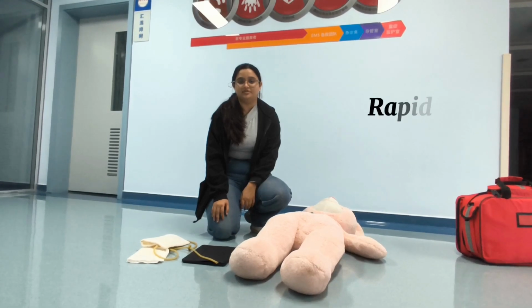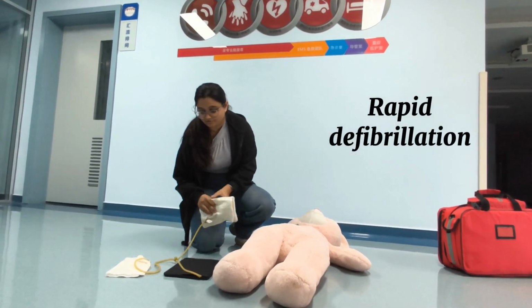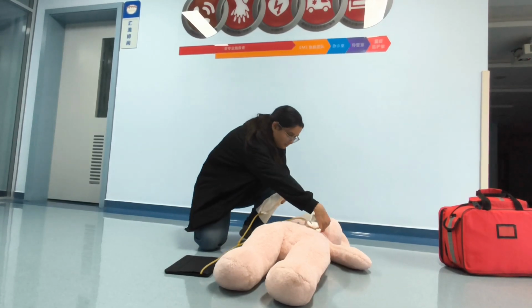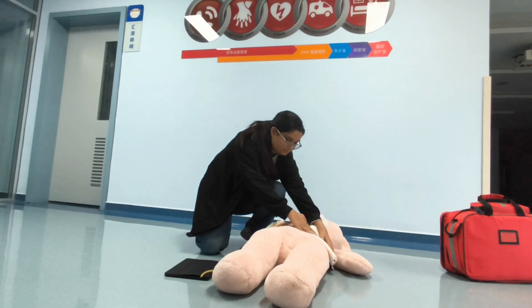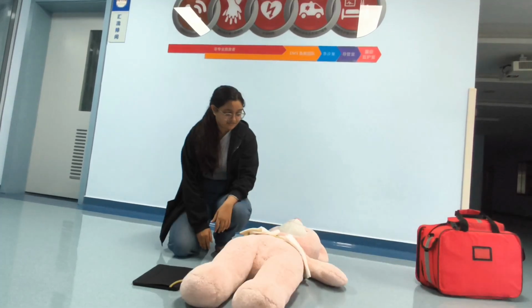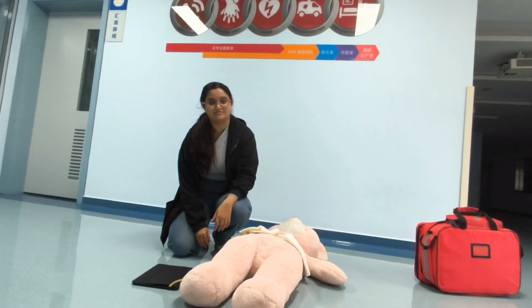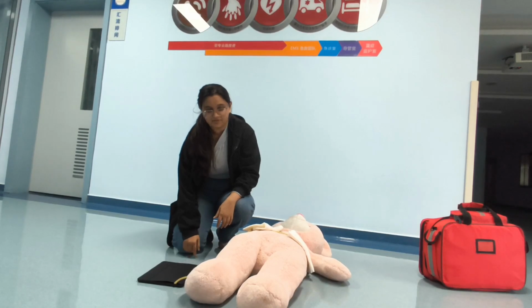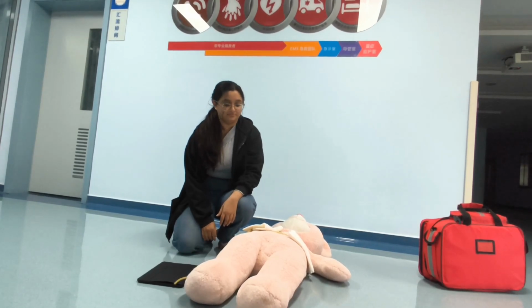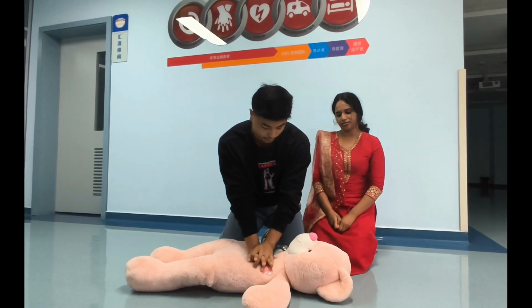Now I demonstrate the defibrillation. First, we turn on the AED machine and then place the pads on the patient. After placing the pads, make sure no one is touching the patient while the machine is checking the heart rhythm. If the shock is needed, press the shock button. After administering the shock, I start the CPR immediately. For the next step, we will do 30 compressions and then 2 breaths.